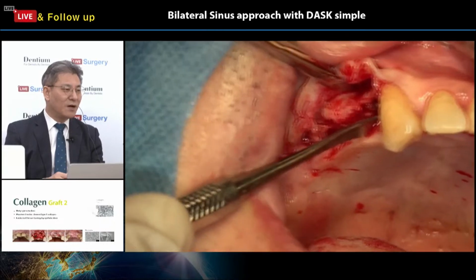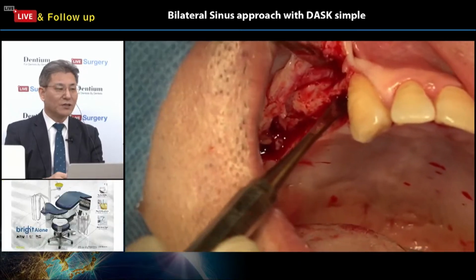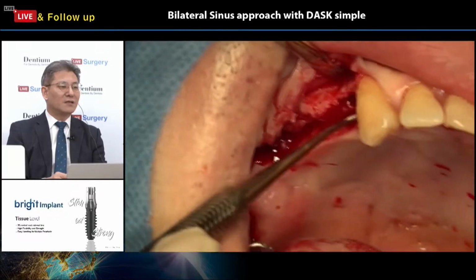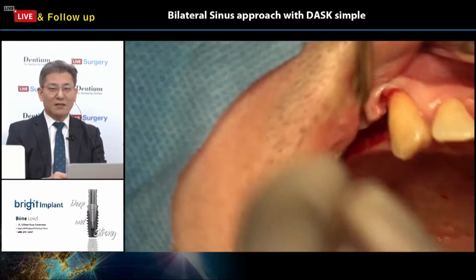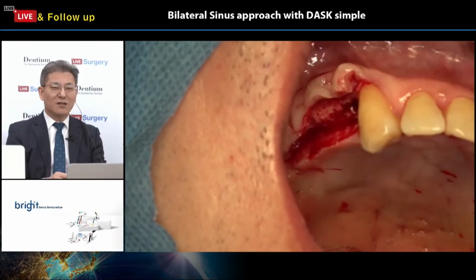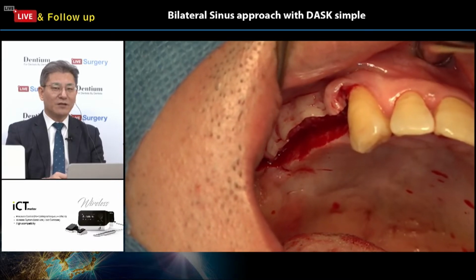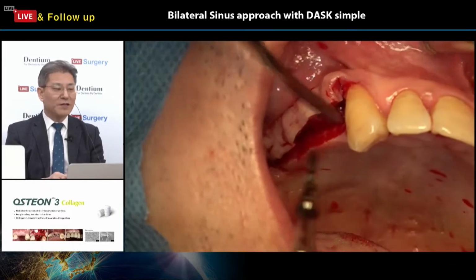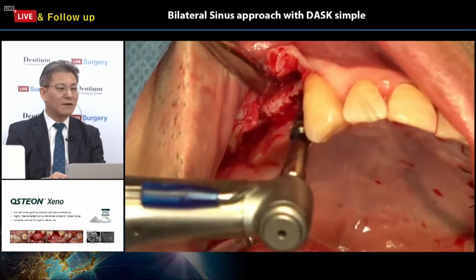The distal part of the canine has a depression, like here. But I think it is not a serious situation. So I think Dr. Chung can simply and easily apply a bright tissue level implant fixture to both areas, number 14 and 15. Okay, so Lindemann first here.